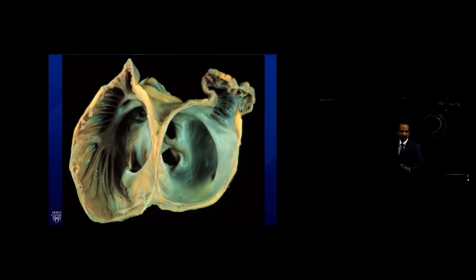Maybe I'll just take a minute to ask one question that Dr. Majumdar is asking. If the veins are silent, do you still need to encircle the veins to create a posterior boundary? The answer is no. But veins, if they're silent, it usually means they're isolated. In most adult human hearts, there will be some myocardium that's viable going into the pulmonary veins. Not true in young children, but most adult hearts, that's true.